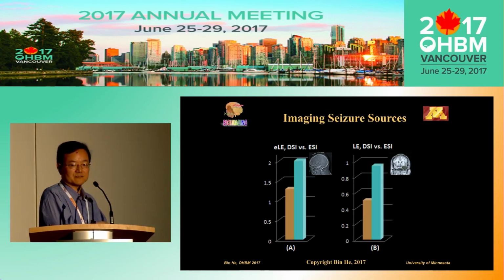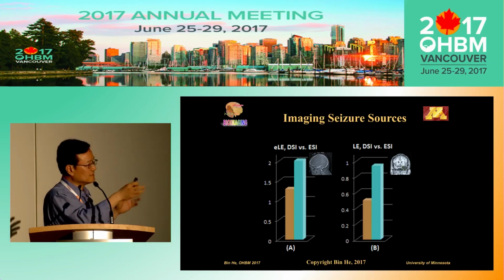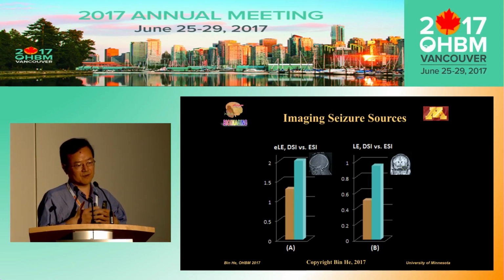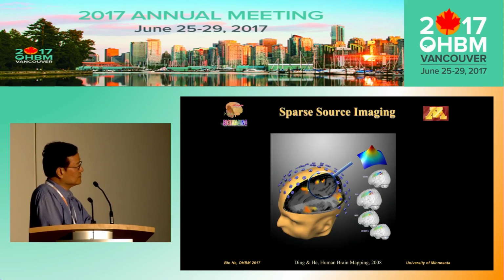And here is a very recent result in a group of patients. First, we compare with the intracranial recording, which defines the seizure onset zone. We found the group average is 1.3 centimeters from our non-invasive imaging result to where the invasive recording is. On the right side, comparing with the surgical resection as quantified by the MRI, we found a 6 millimeter localization error from the source imaging result to the edge of the resected area, which is quite an encouraging result, and this work is still ongoing.